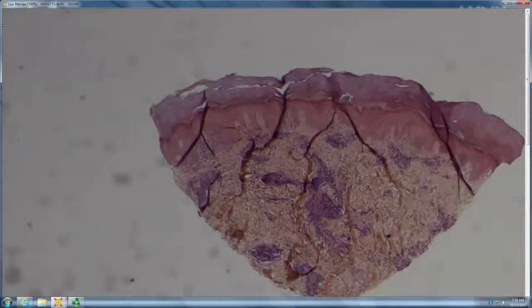That is segmental hyalinizing vasculopathy. Very good. Okay, Sarah, where are you on the body? Looks acral. And what do you see?